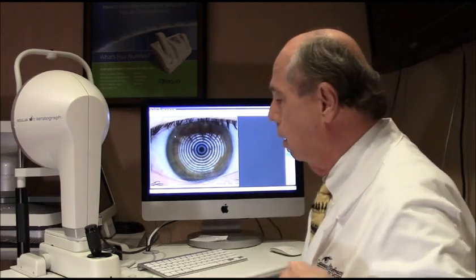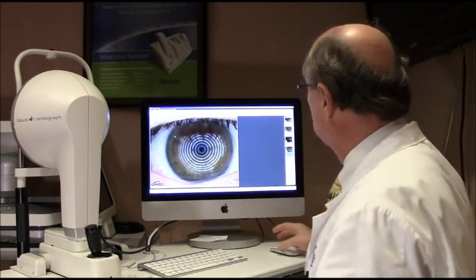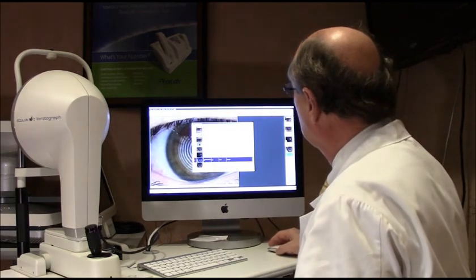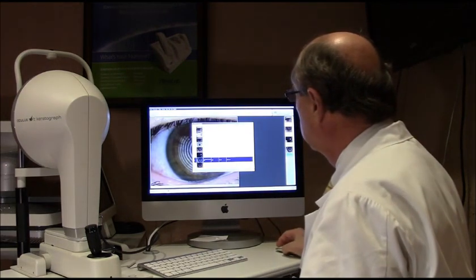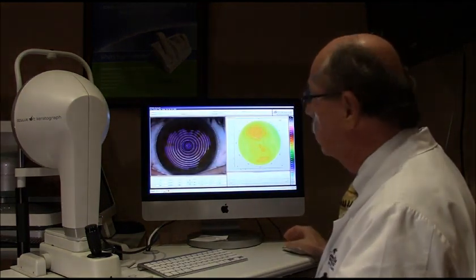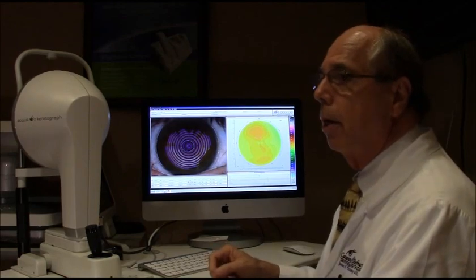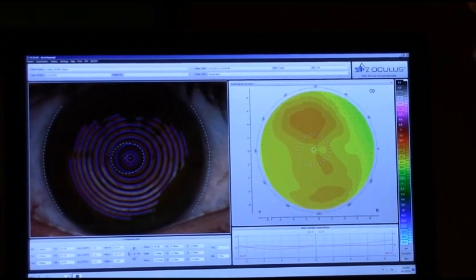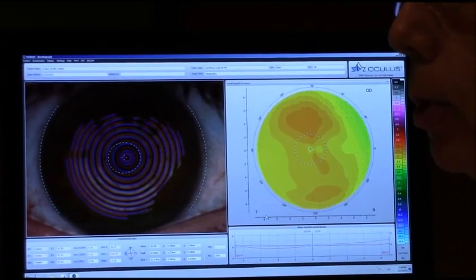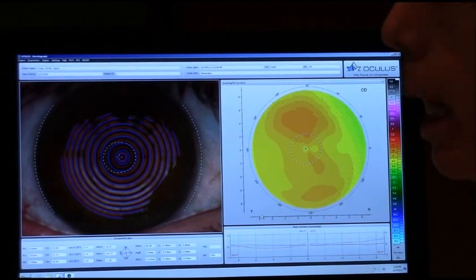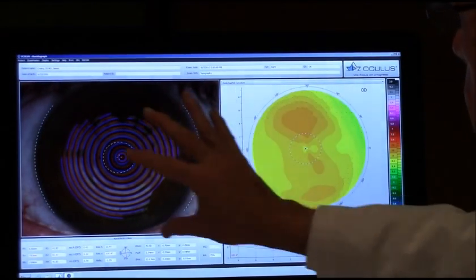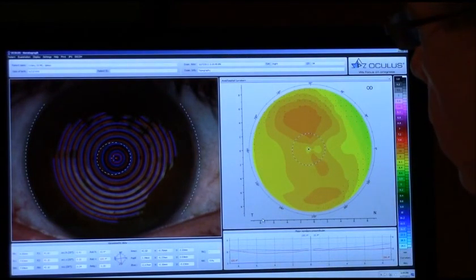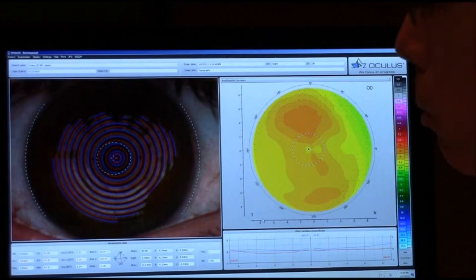The first thing we're going to do is go over some of the tests that this machine allows us to do. The first one I'm going to show you is the corneal topography, which measures exactly the curvature of your cornea. We use these measurements typically for cataract surgery and for fitting contact lenses. This shows us exactly the shape and contour of your eye — this is a typical topography of someone's eye.